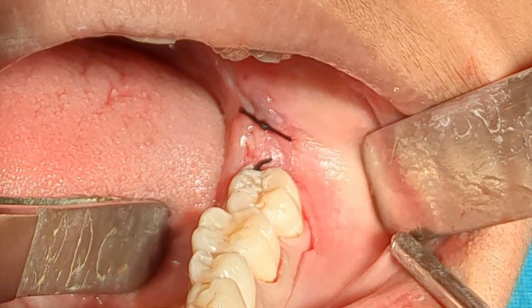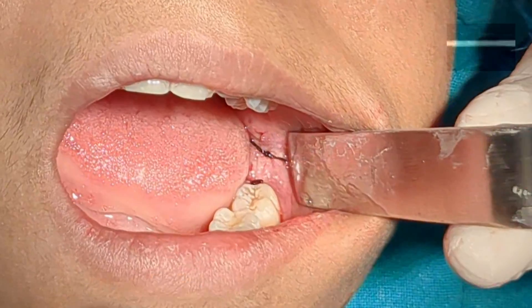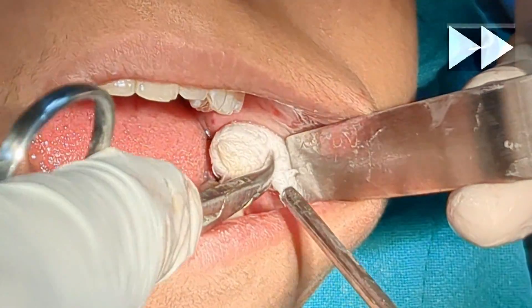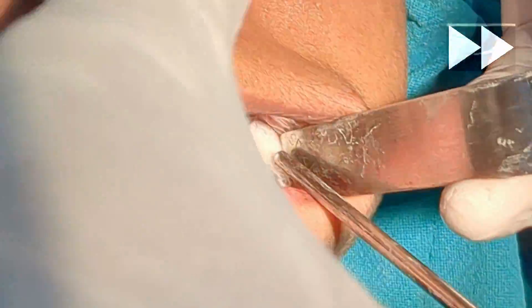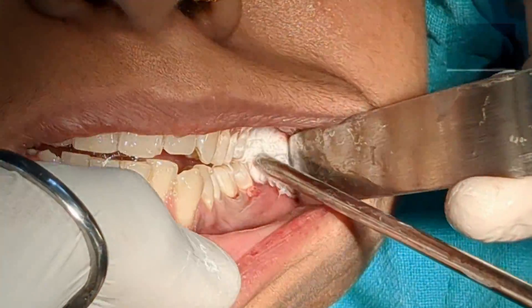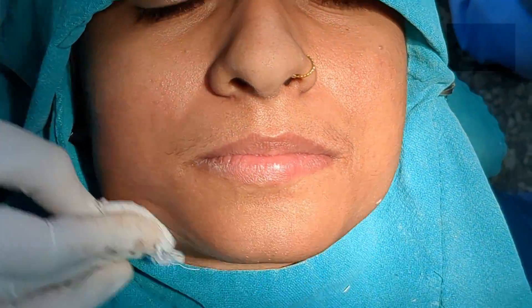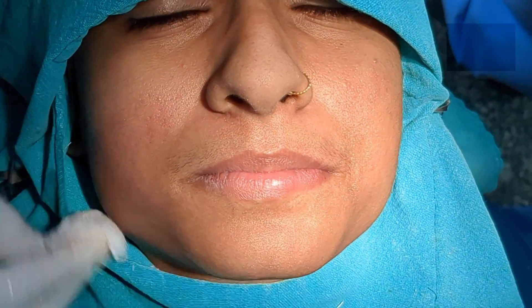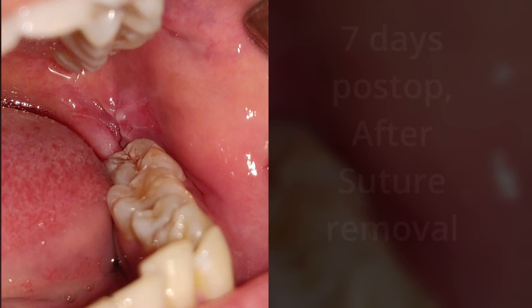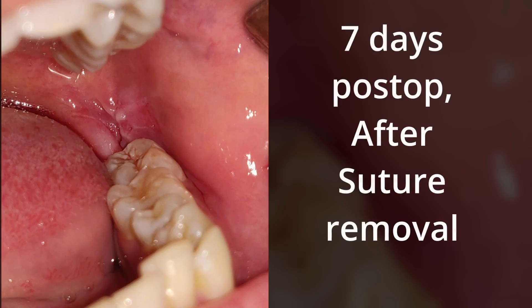This is how the flap looks after it is sutured back into position. The pressure pack should be sitting over the extraction socket and not interfere with the occlusion. Make sure that the patient's face is clean of any blood spots. This is the surgical site one week after the surgery.